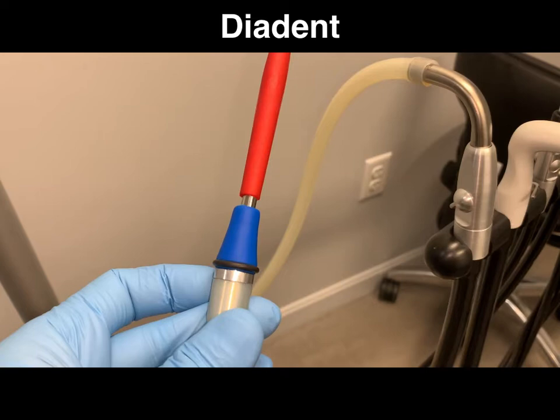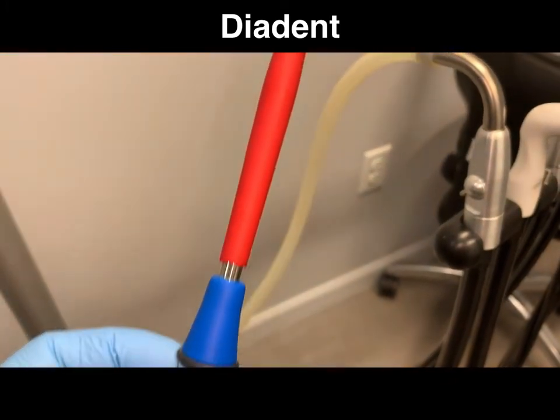So I attached the Diadent to this saliva ejector rubber tip. I forgot what it's called. I get it from Practicon. It locks on pretty well. So if you happen to have issues with the rubber end of your saliva ejector valve coming off, these work very well. So I just got this adapter that I slide onto the tubing. I use this, and I can just stick this mirror into this tubing so I get more suction out of it. Now these can be used with a saliva ejector valve, but the suction is not as good.